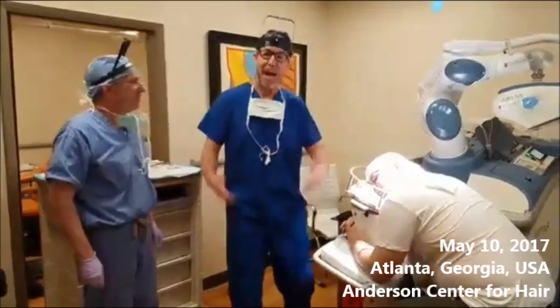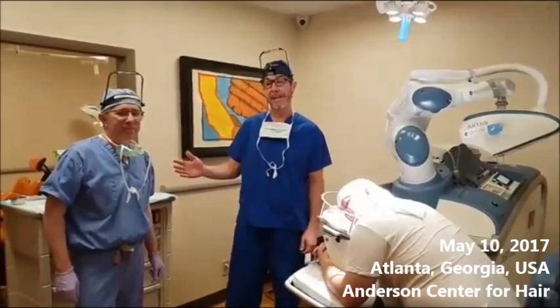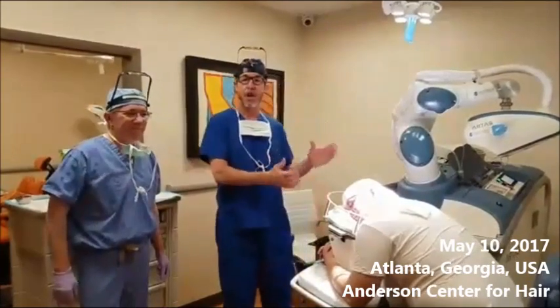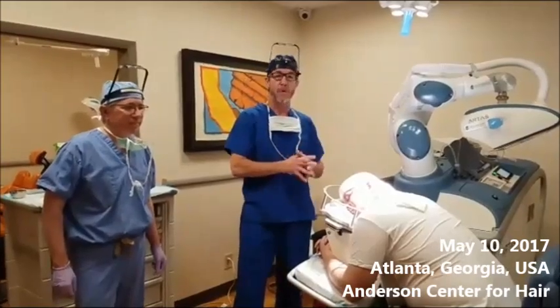We are live. My name is Dr. Ken Anderson. We're here at the Anderson Center for Hair with Dr. Lee and our patient, Charles. And today, I'm going to walk the audience through how we get a grid started.